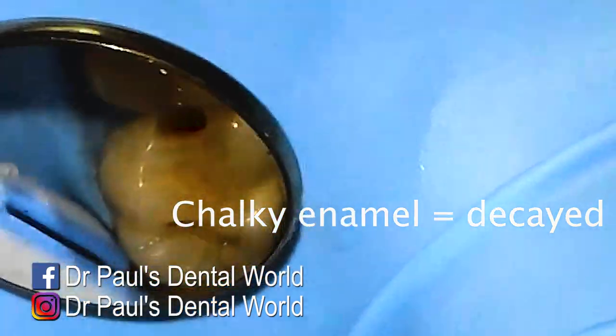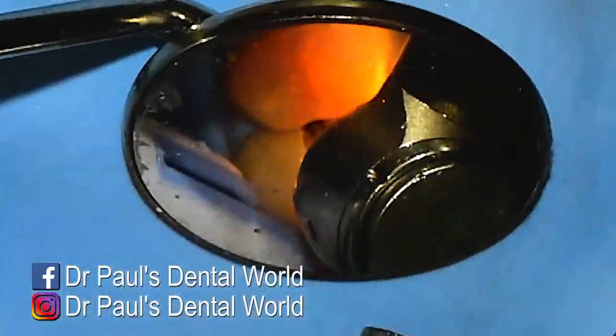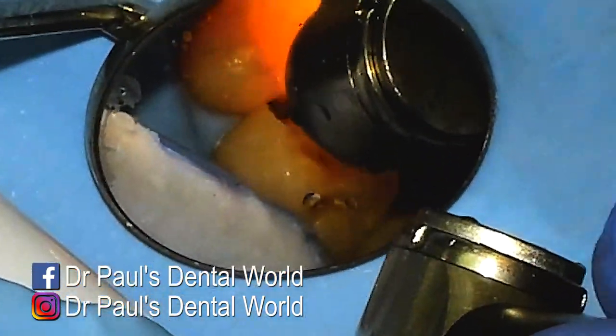Can you see how that's a bit chalky white color? That chalky white color is the starting process of decay. So that enamel is quite weak as well, so we have to remove that too when we are removing the decay.